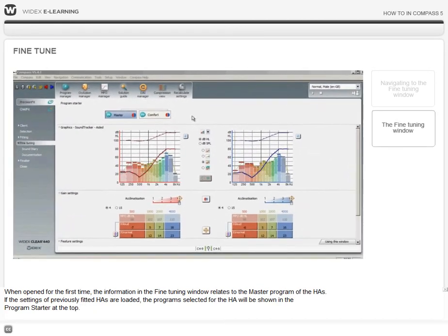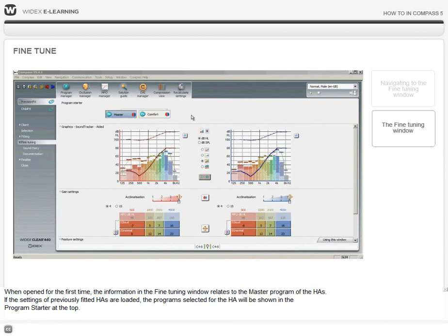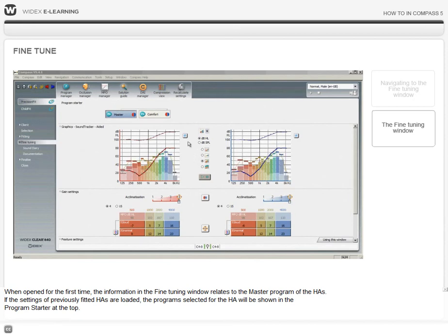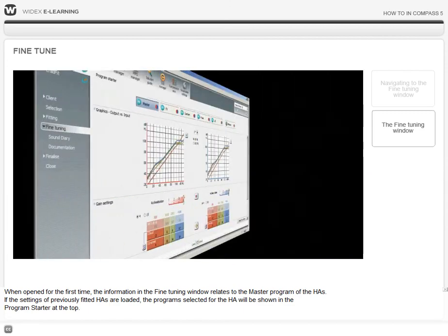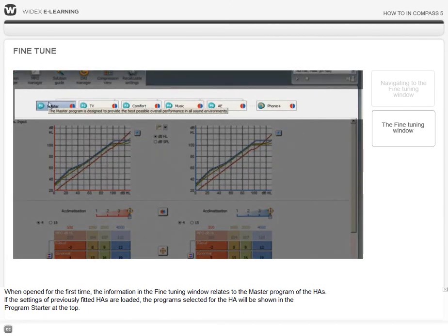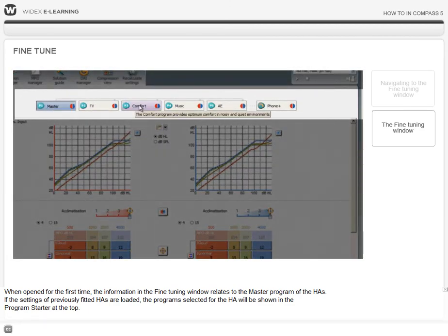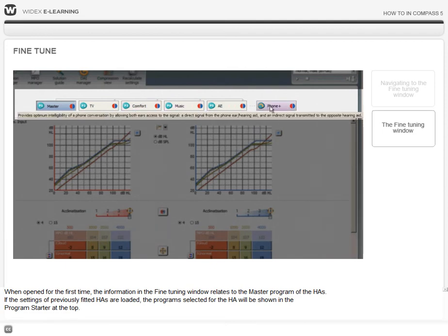When opened for the first time, the information in the fine-tuning window relates to the master program of the hearing aids. If the settings of previously fitted hearing aids are loaded, the programs selected for the hearing aid will be shown in the program starter at the top.